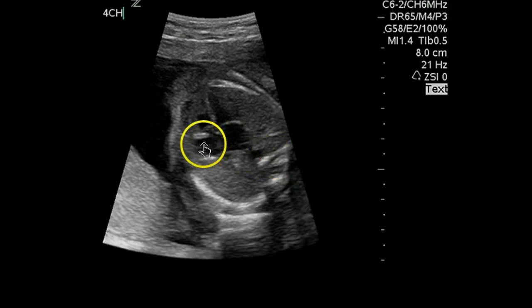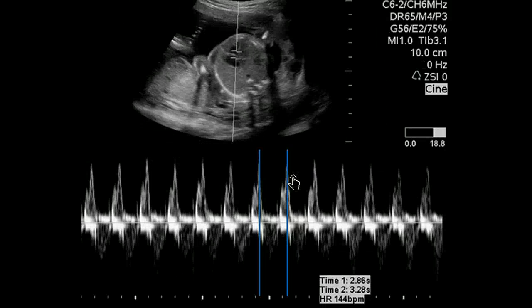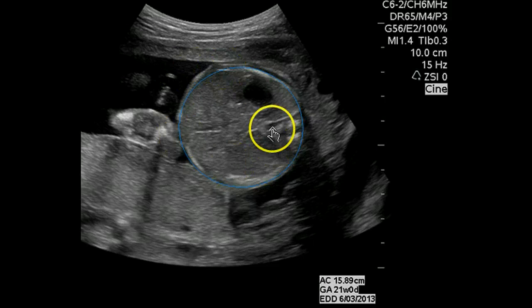And now we're going down a little lower. We see the 4-chamber view. You draw your imaginary line here, and here, and it's at about a 45-degree angle, and this is going right through. Let's make this the middle of the chest. Here's the two ribs. We're a little bit obliqued. We're going to say maybe right about there, and that line goes perfectly through what we like to see. Heart rate looks normal. Here's an abdominal circumference view. We see the stomach.